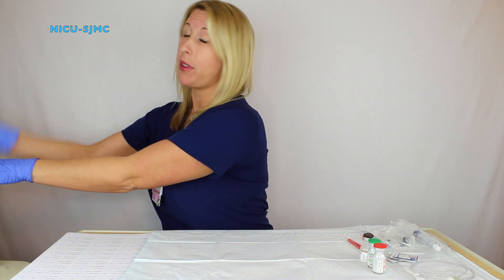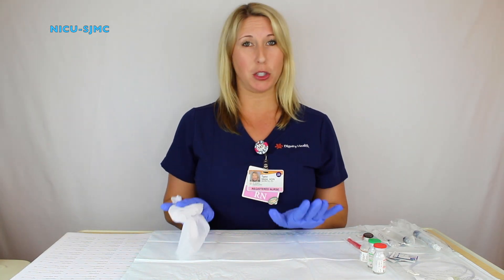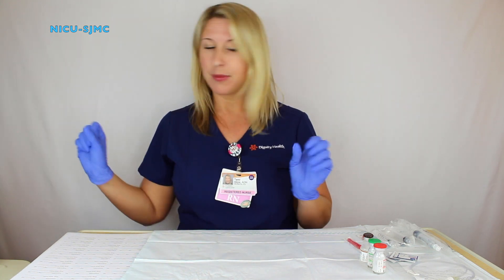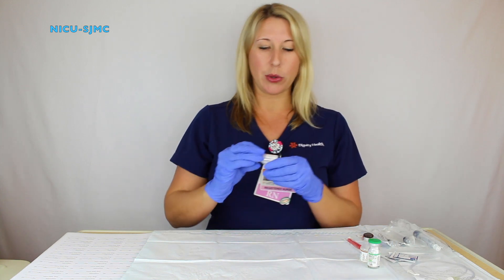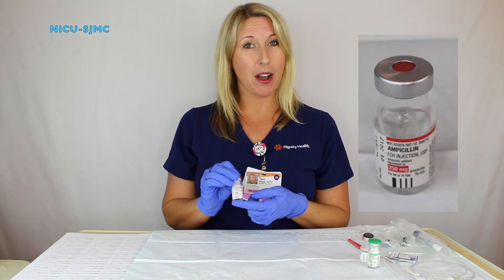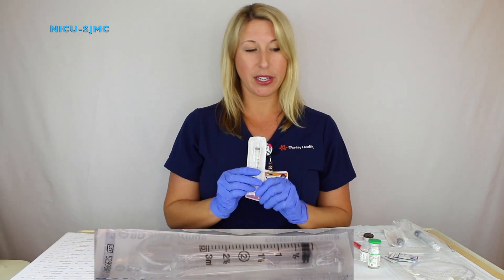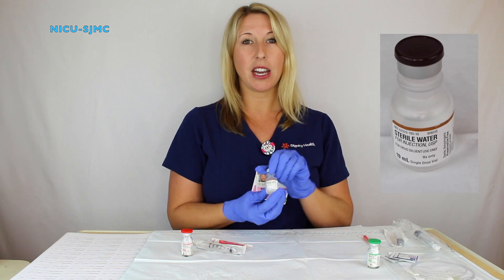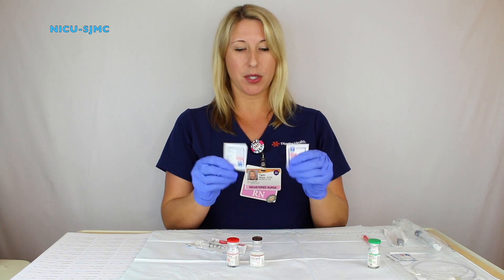Clean the area and have a side wipe. For demonstration purposes, I am not doing this as this is not the area. Grab your supplies. If you are using a 250mg vial of ampicillin, you will need a 3ml BD syringe, a blunt fill needle, sterile water, and the ampicillin itself. Two alcohol swabs.